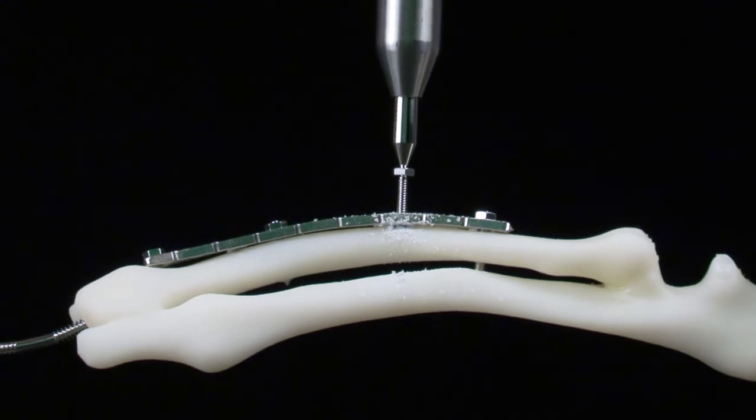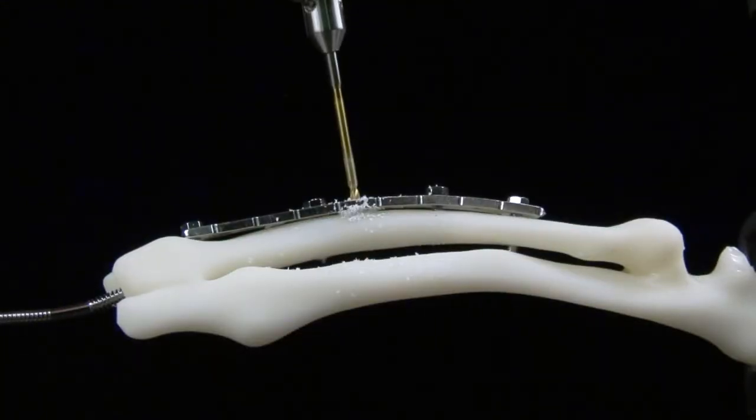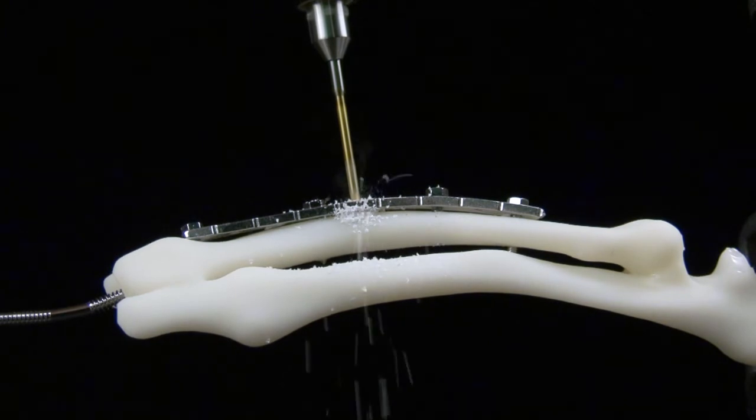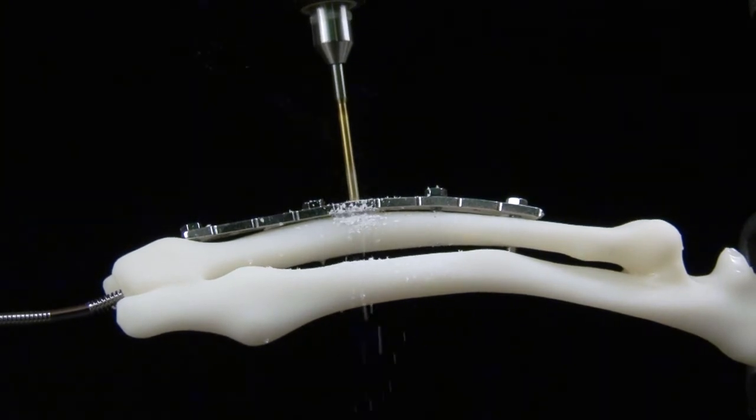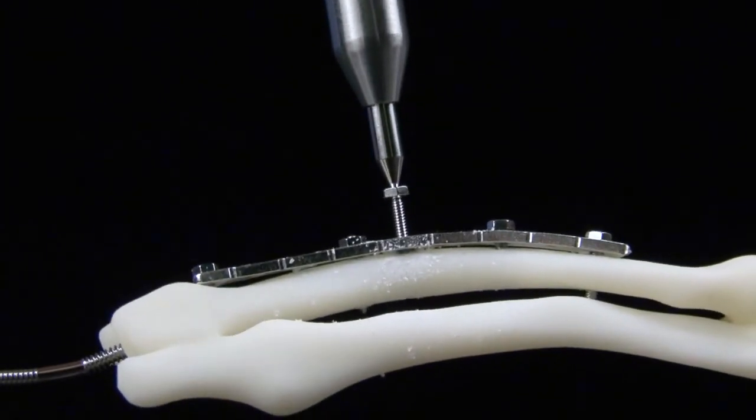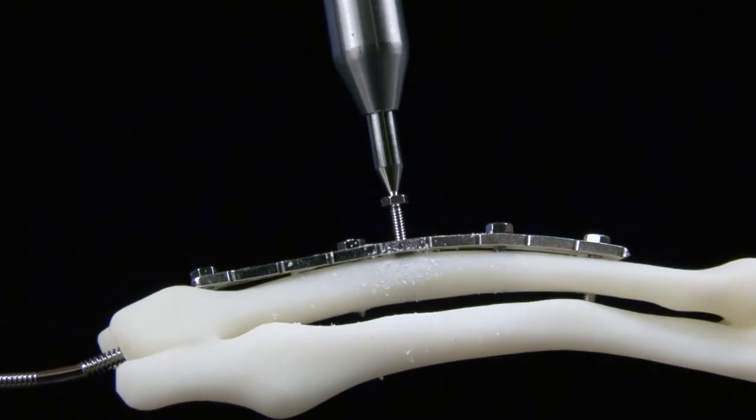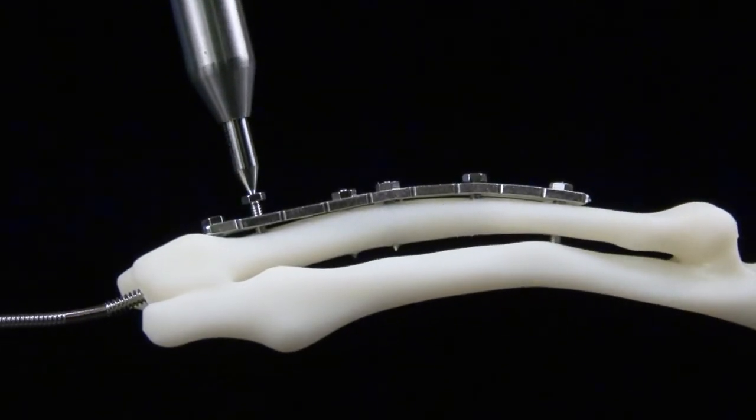After verifying proper fracture reduction and bone alignment, fill the remaining desired screw holes with screws using previously described techniques. The integrated screw shafts can now be safely removed immediately after inserting each screw.